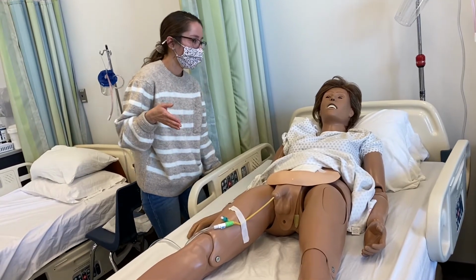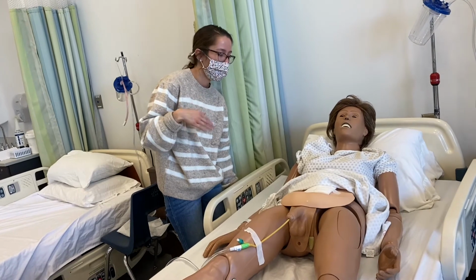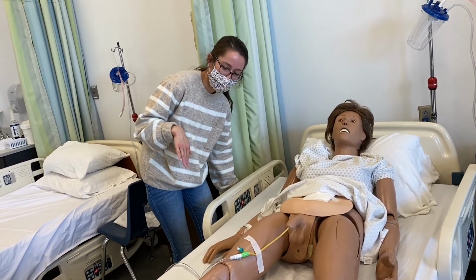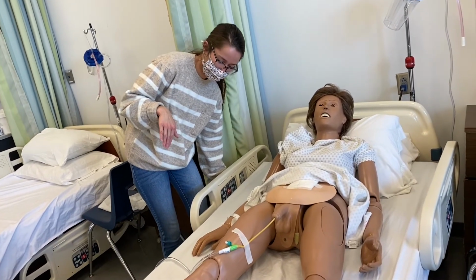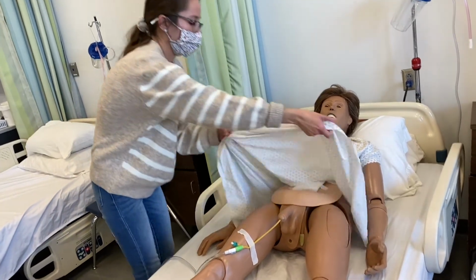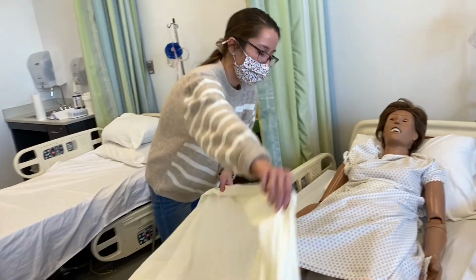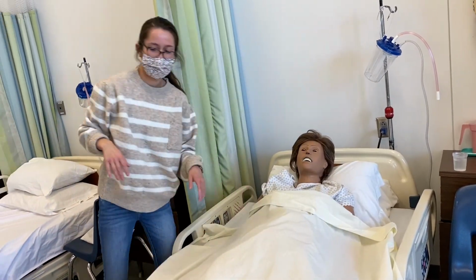I would ask Carl how he tolerated the procedure, if he's in any pain on a 0 to 10 pain scale. I would lower him all the way down to the floor. And I'm going to cover him up and put his blankets up, keeping him comfortable, and then I would be done.